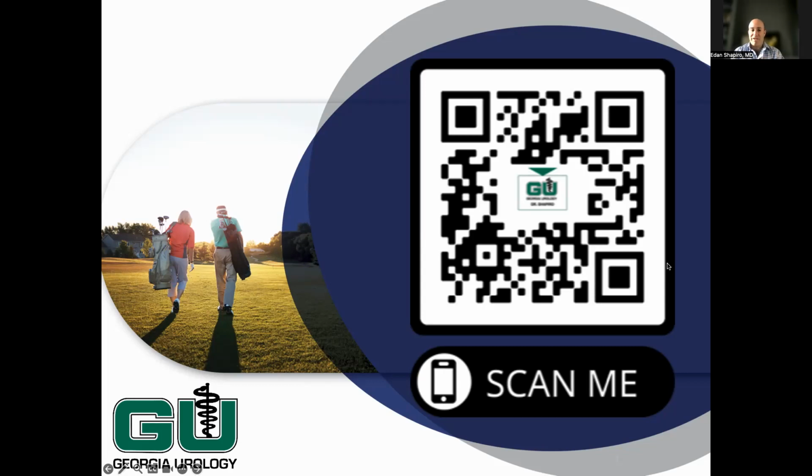So stents are interesting. When people think of stents, obviously the most common things that we think about are stents that go in the heart. And the reason that stents in the urinary system are very different from stents in the vascular system is that people can get kidney stones, and people get kidney stones because there are crystals in the urine that can stick to the inside of the kidney, and as you get a stone, it can get bigger and bigger.